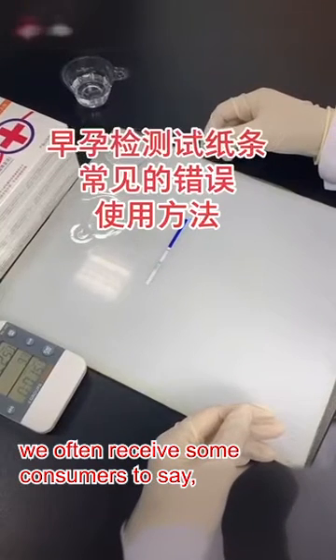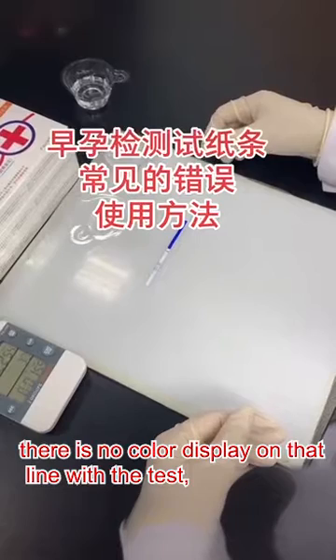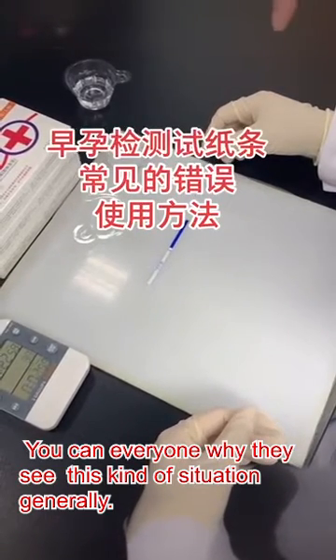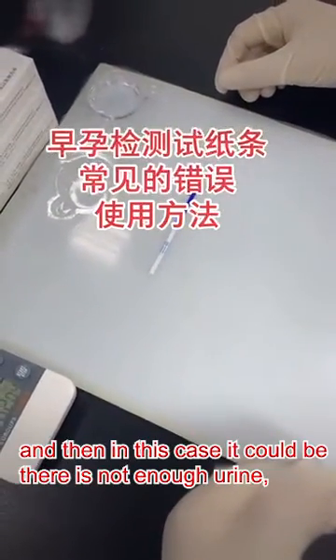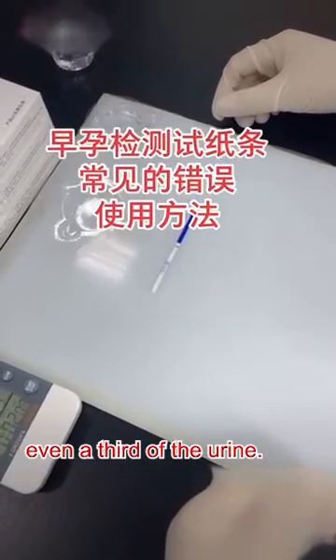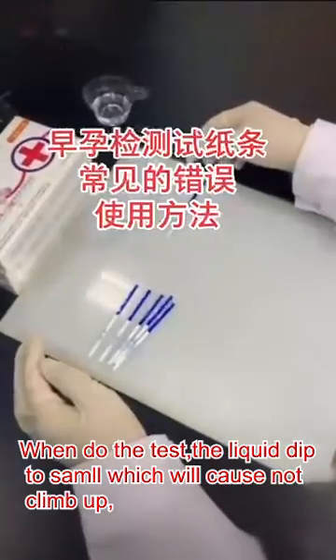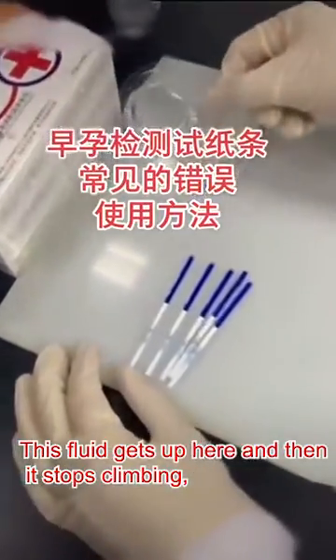We often hear consumers say there is no color display on the line of the test, and they can't see the line. Let me explain why this happens. I'm going to take another strip out. In this case, there may not be enough urine, even a third of the urine. When doing the test, the liquid dips too little, which will cause it not to climb up. This fluid gets up here and then it stops climbing.